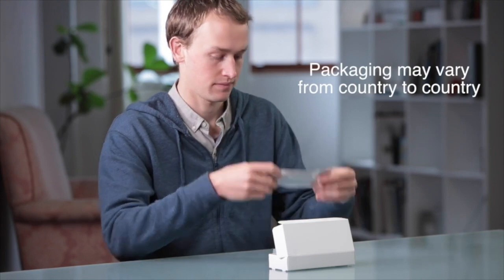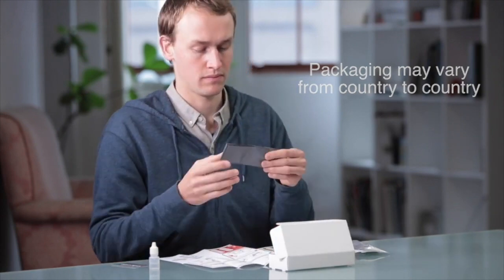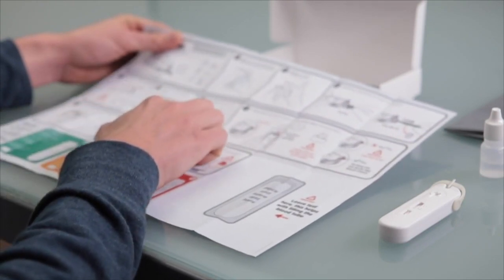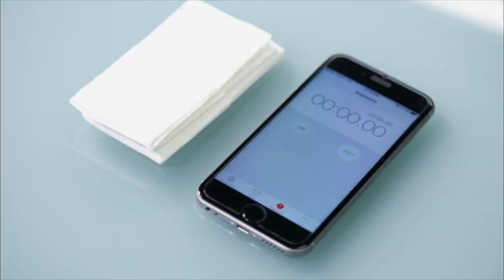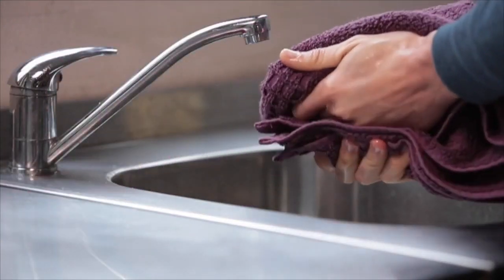Inside you will find a foil pouch containing the self-test, a bottle of test fluid, instructions and a plastic waste bag for discreet disposal. Before you start the test, read the instructions carefully to familiarise yourself with the testing process. You will need a timer and something to wipe your finger with at the end of the test. Now wash and dry your hands to make sure that they are clean.